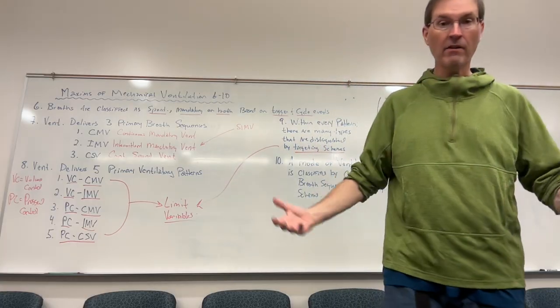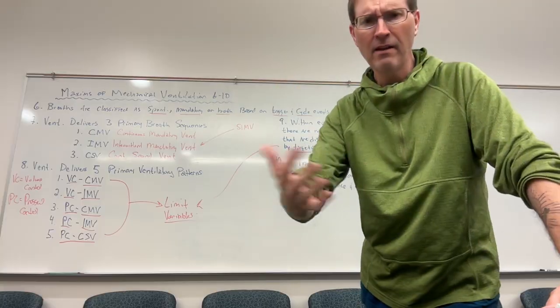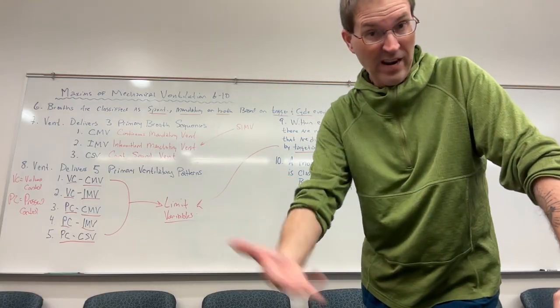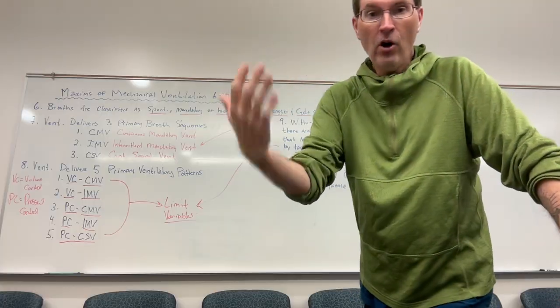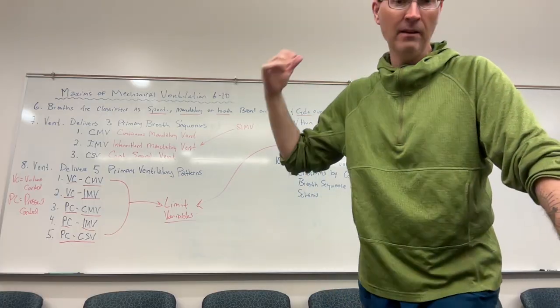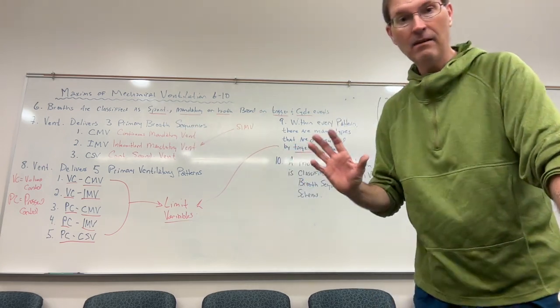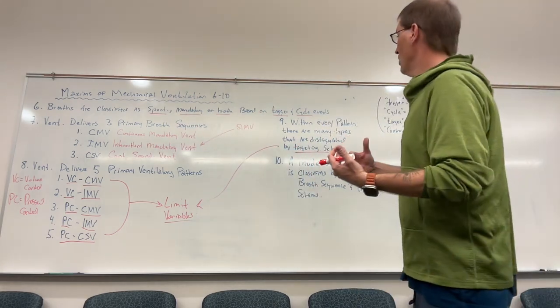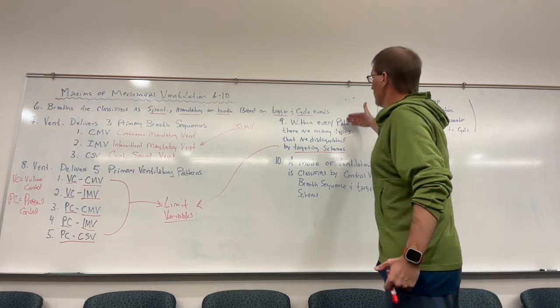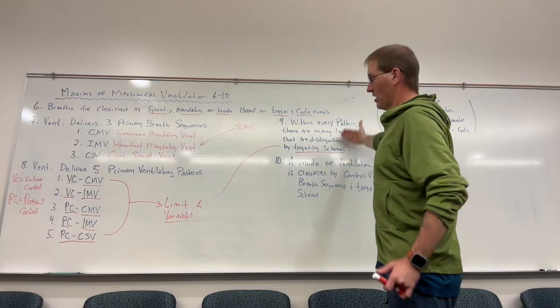types of modes that can be distinguished by targeting schemes that are mainly using limiting variables. And this is where a lot of the confusion of the names of modes, the trade names that come out, like volume control plus and all of these names, and a lot of the complex naming conventions comes down to what types of specific targeting schemes are being used.